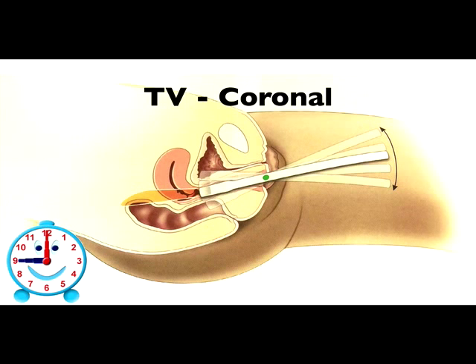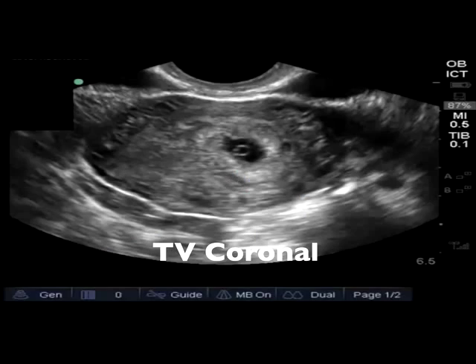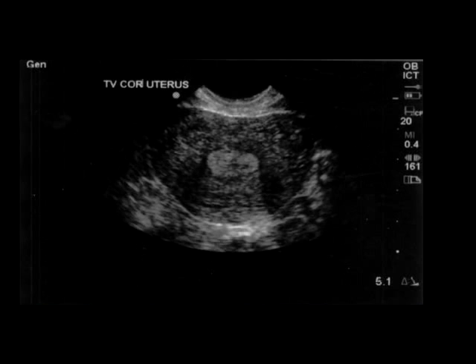We're going to move the ultrasound transducer both anterior and posterior. I usually start by visualizing the bladder — I'll drop my hand to visualize the bladder which is anterior, and then slowly move the ultrasound probe angled posterior in order to visualize the entire endometrium. On the image obtained from the anterior view, at the very top of the screen you can see the bladder on both the right and the left. Just deep to that we can see the uterus and the endometrium. This is a patient who has a visible yolk sac. Another way to identify that this is a coronal image is that the uterus is circular in shape.